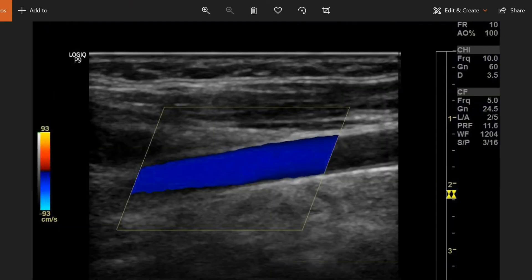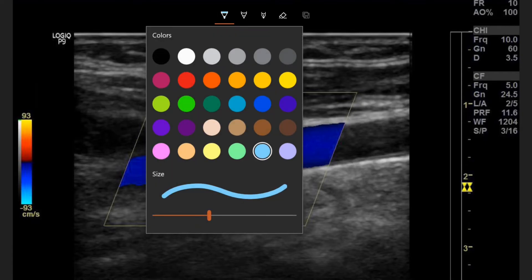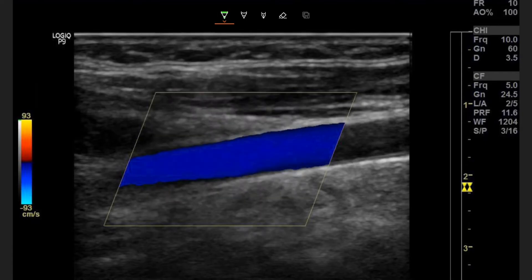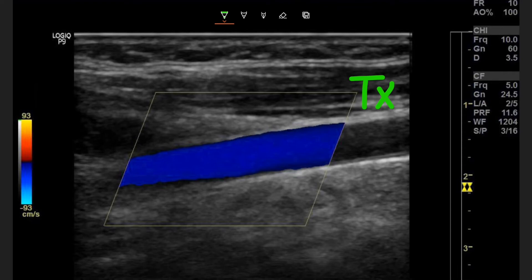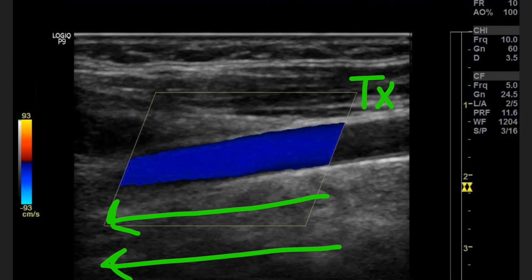Now the color in our vessel is blue. We still have the same transducer location — still steered the same way, so our transducer location is still over here on the right. Looking at our color map, blue is on the bottom, meaning blue is going away from the transducer. So the directional flow in this vessel is from right to left.